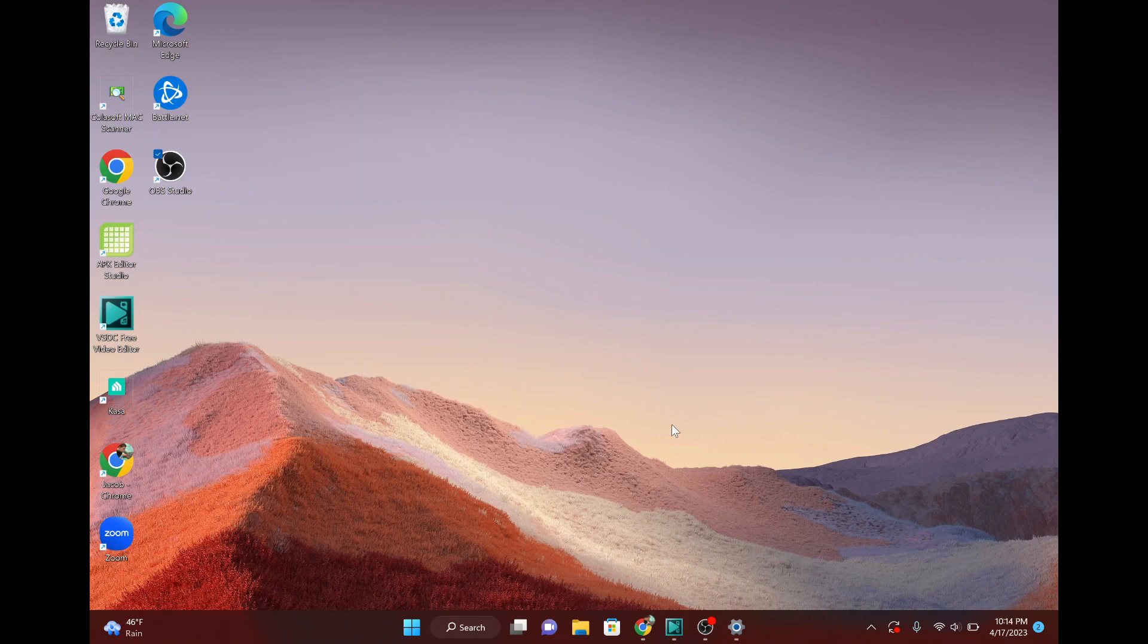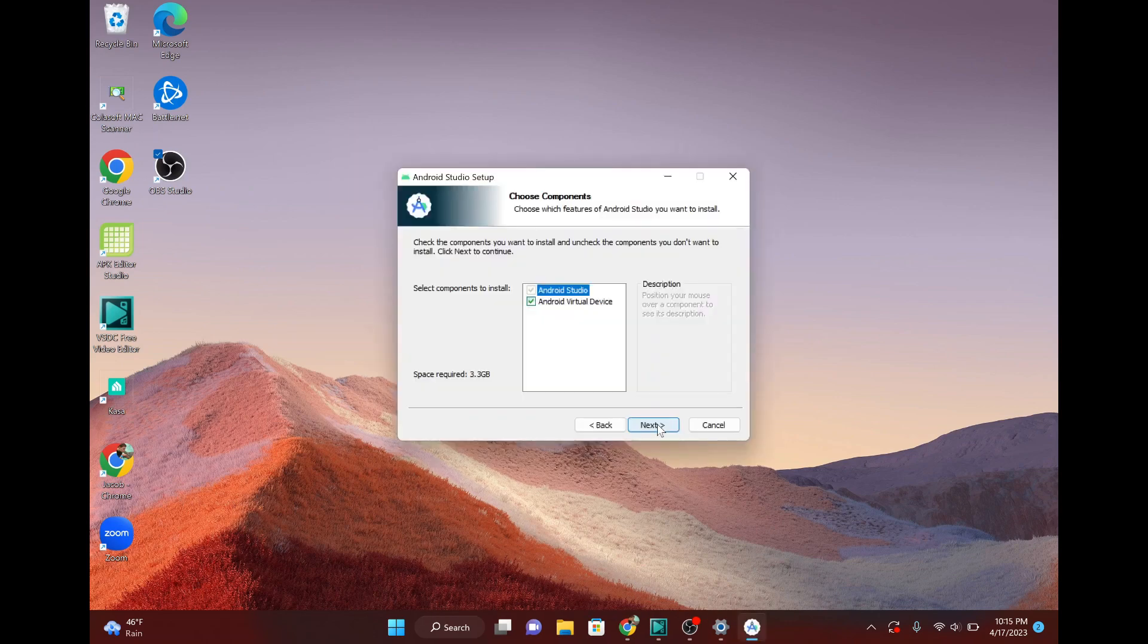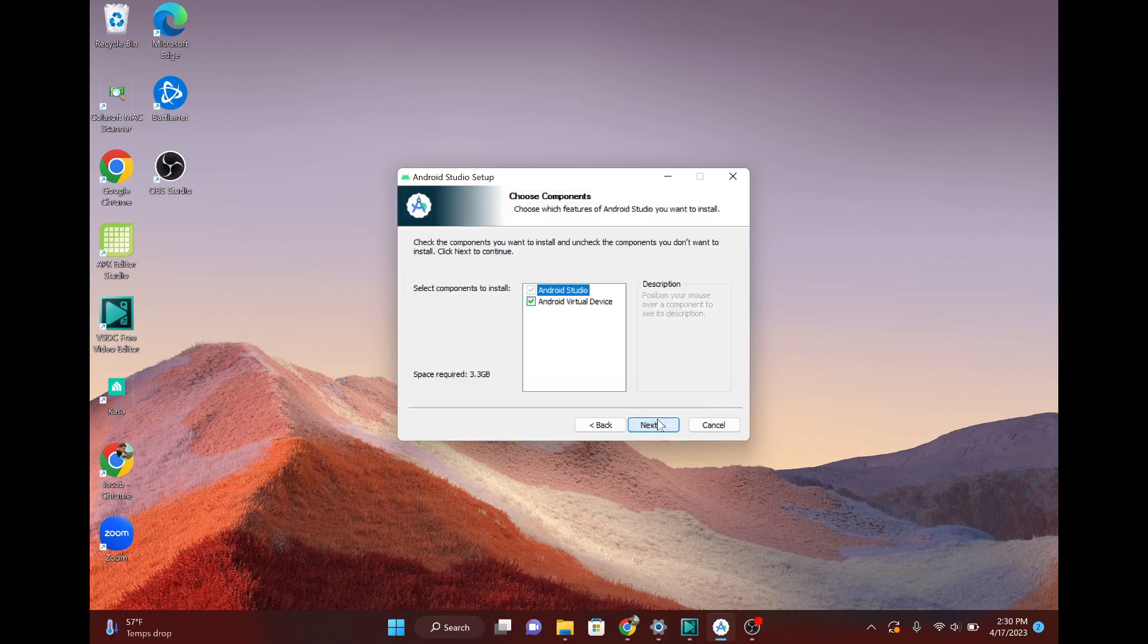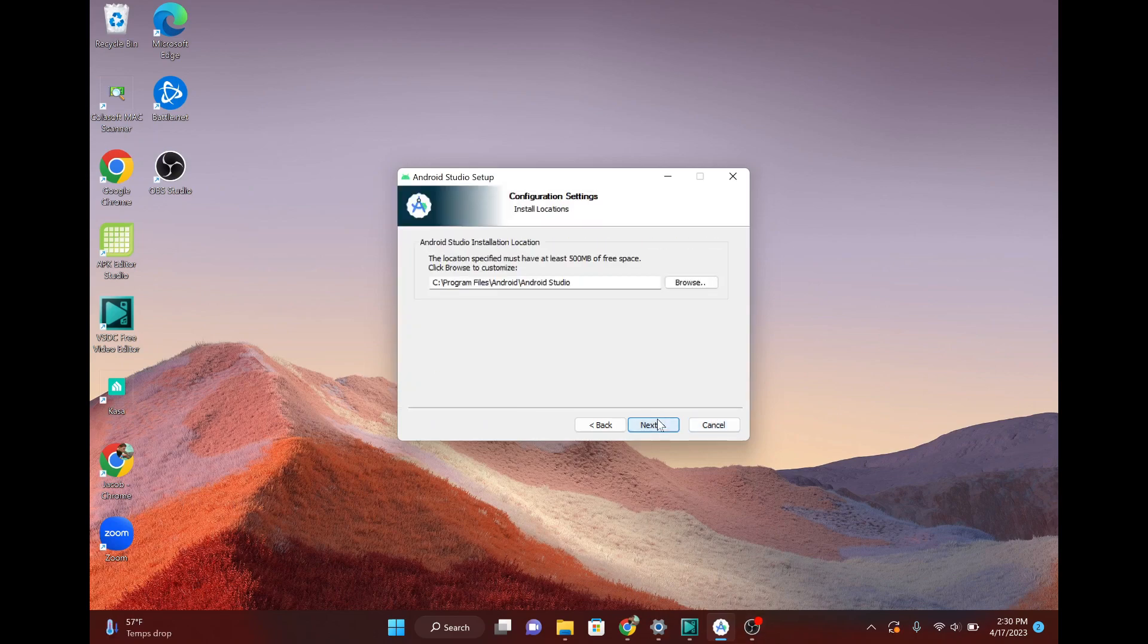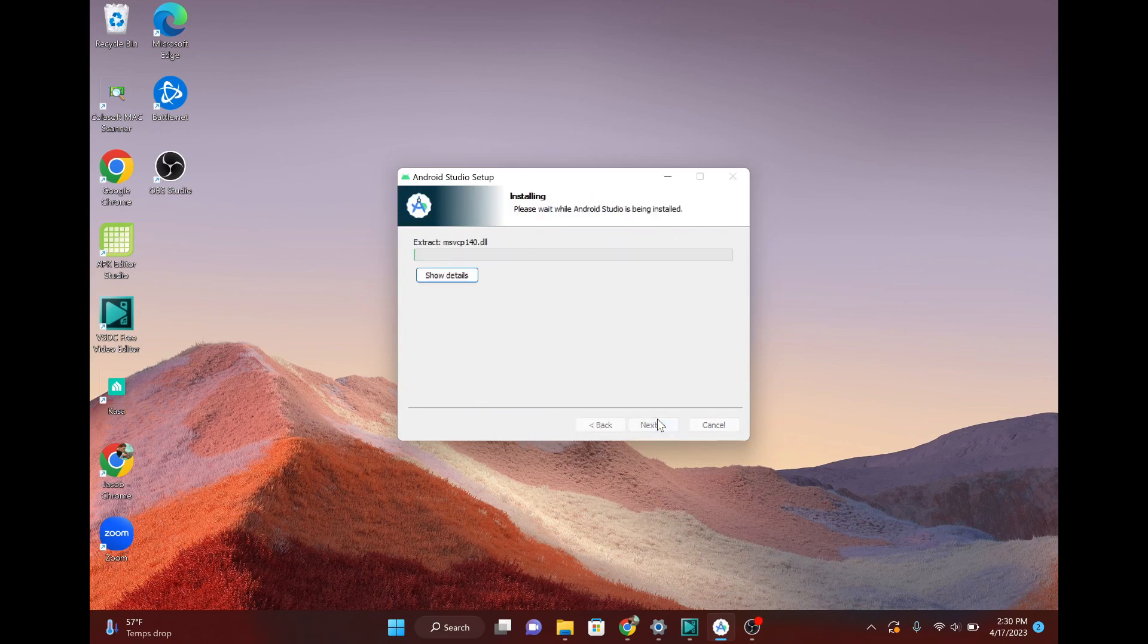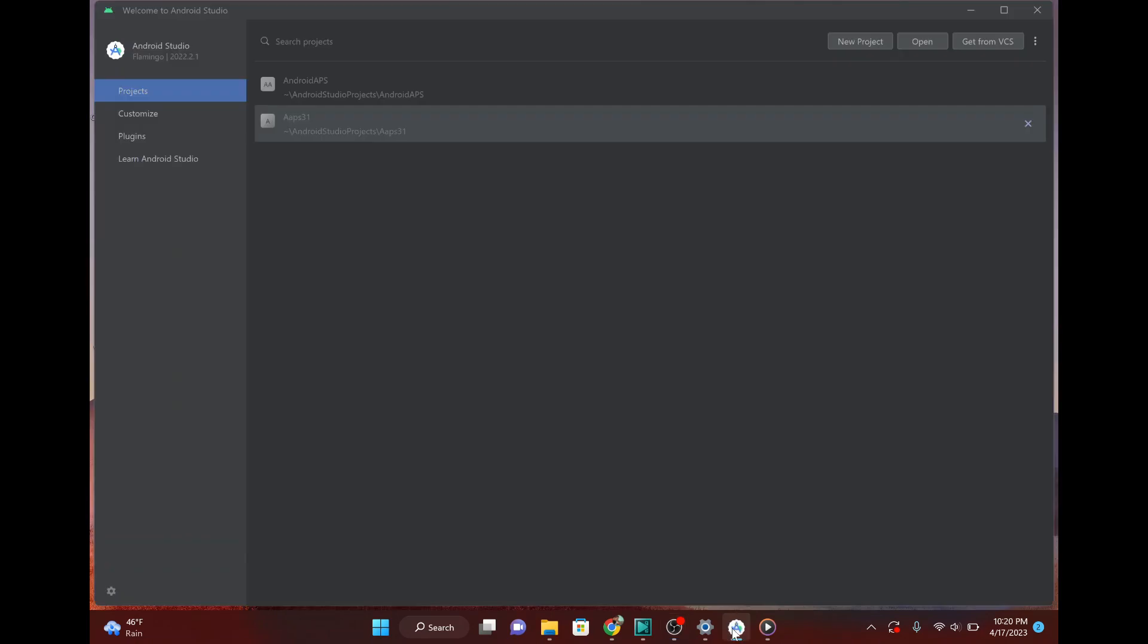So let the setup go. It's going to make changes to your computer. Just hit next. Just again, we're going to just basically just install everything.